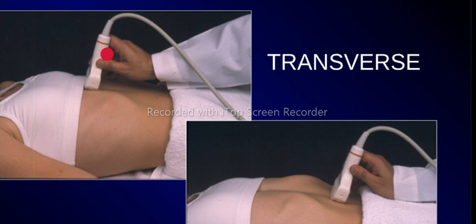Pancreas lies oblique to the abdomen. The head is dipped down and the tail is towards the superior aspect, or it's more superior than the head. So if you saw a mass, let's say in the abdomen, and you're able to see the pancreatic head close by, that means that mass is somewhere on the lower end. If you saw a mass and you're able to tell that this mass is near the tail of the pancreas, that means you're looking at the splenic hilum or the upper part of the left upper quadrant.